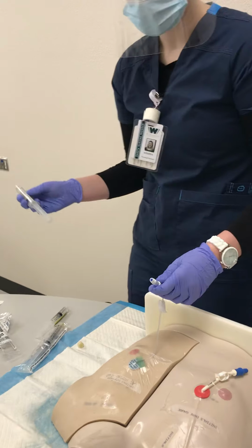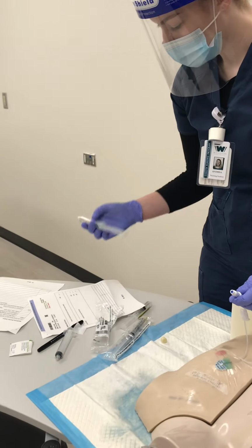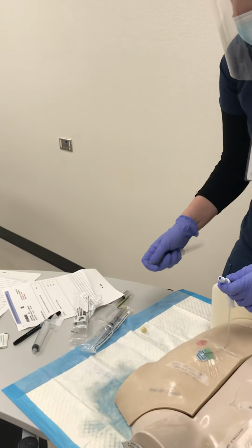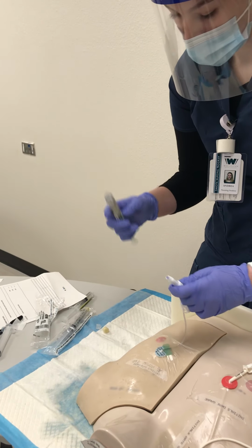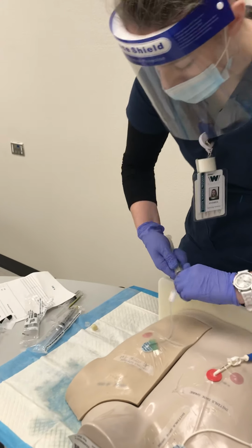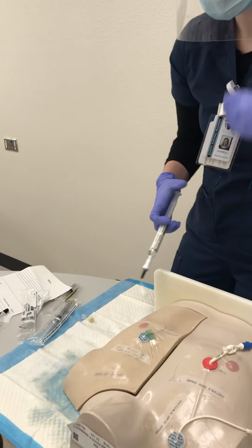So one last time before I give it, I'm going to do my last med check. So I have ceftriaxone 1 gram and 10 milliliters per 1 gram. And it was given 8 hours ago, so I'm good to give it. So undo that and make sure that the air bubble is out. And then we can attach this because we have kept the top clean. And then unclamp that. And another push-pause method.